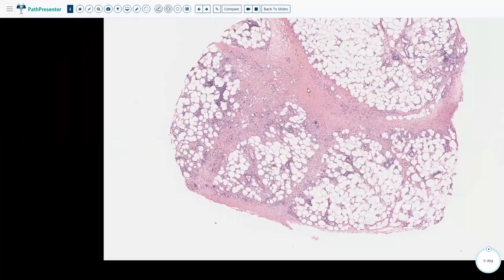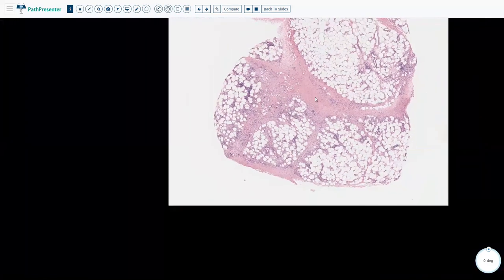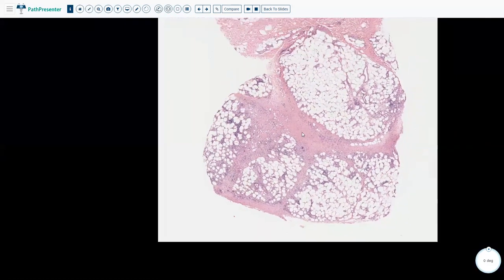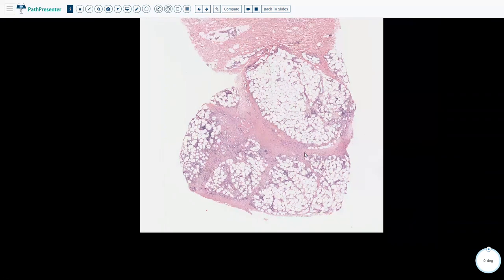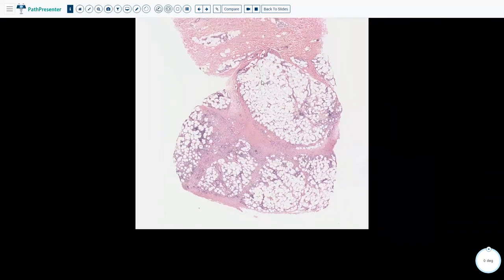In septal paniculitis, what we see here is very thick and fibrotic septa with chronic inflammation and granulomas. This is the prototypical lesion of septal paniculitis, which is erythema nodosum.